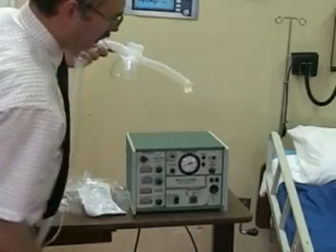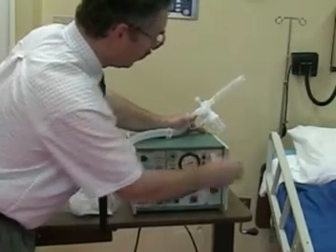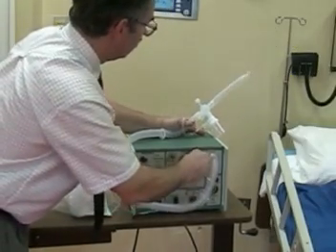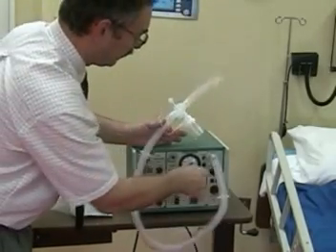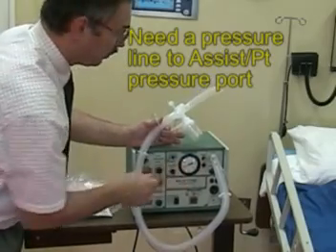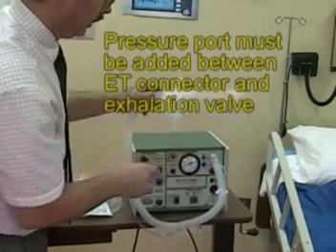There is the large bore patient connection which the tubing connects to, as well as the patient exhalation valve. Lastly, you'll need to establish an airway pressure line which is going to be connected into this part of the ventilator circuit.